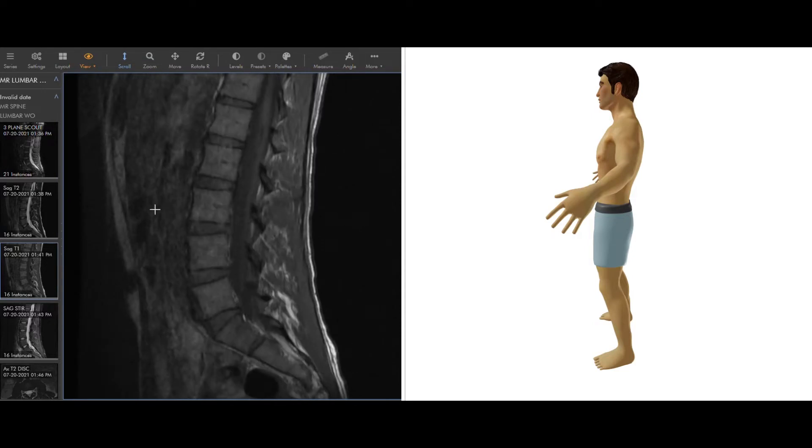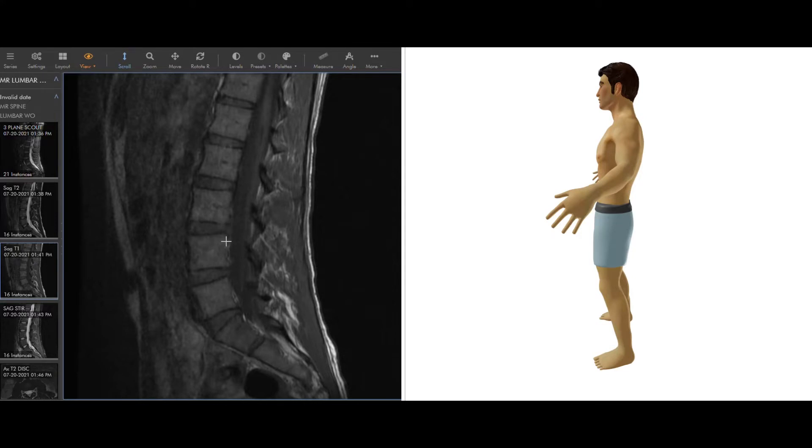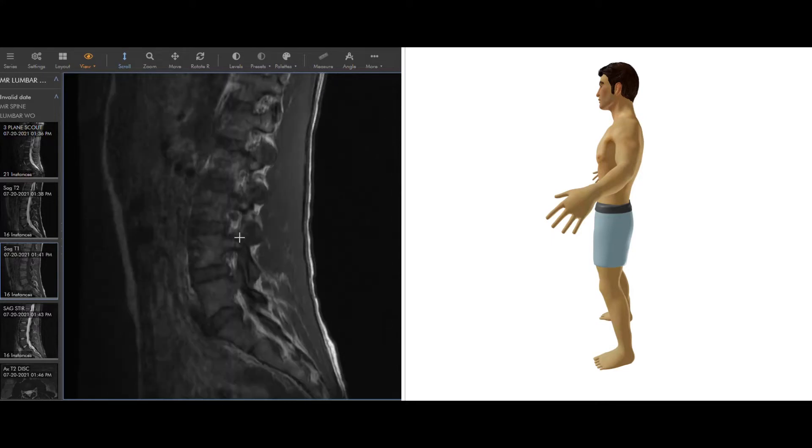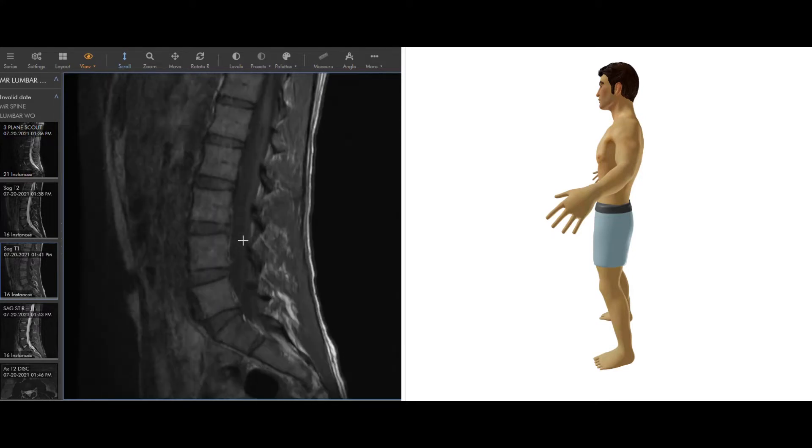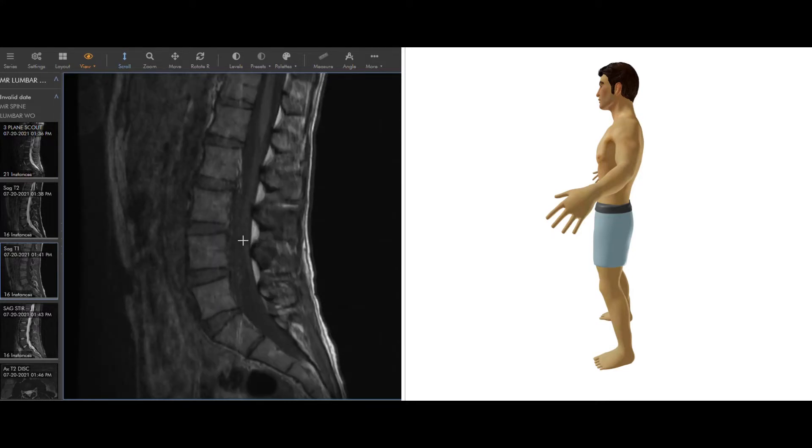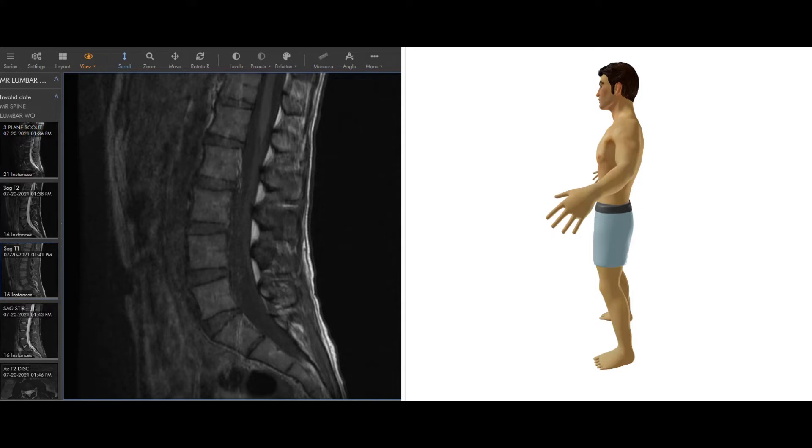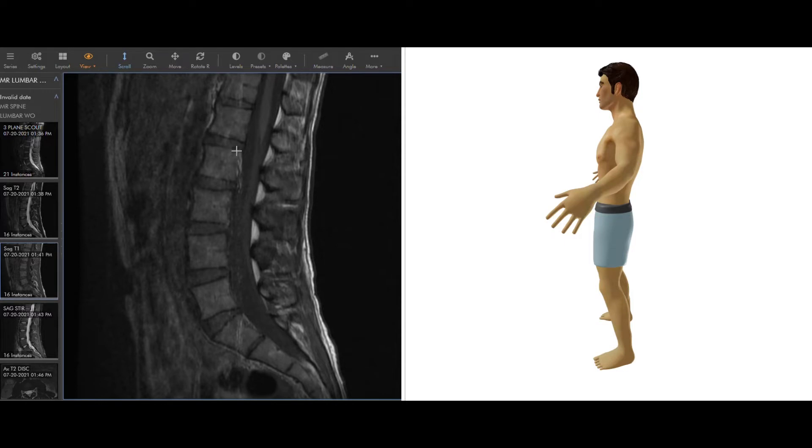Over here we can see these words, this says sag T1, that's actually sag for sagittal or side view, and T1. So T1 is one of the terms we use for what type of sequence this is. The magnet that interacts with us that makes these images can be modified in different ways, and we can get different colors on the images here, and that helps us as radiologists figure out what's going wrong.